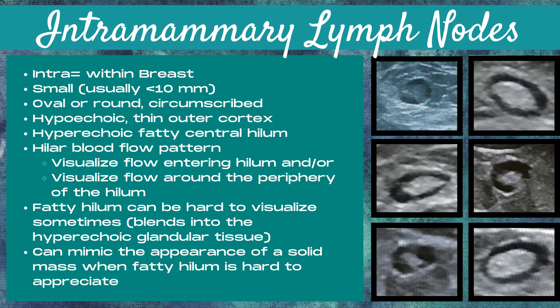They have a hypoechoic thin outer cortex, a hyperechoic fatty central hilum, and a hilar blood flow pattern — meaning we visualize flow entering the hilum and/or flow around the periphery of the hilum.